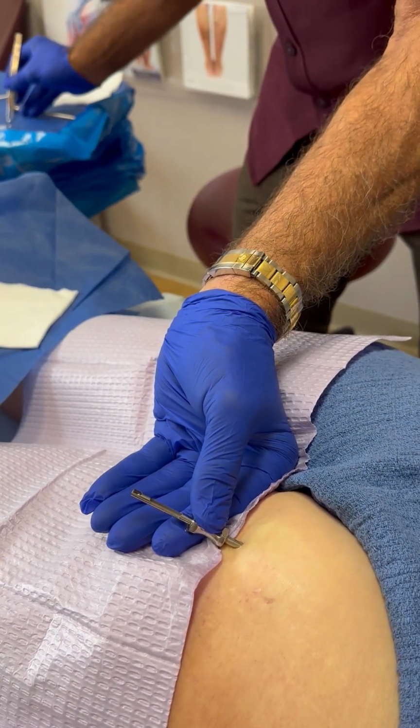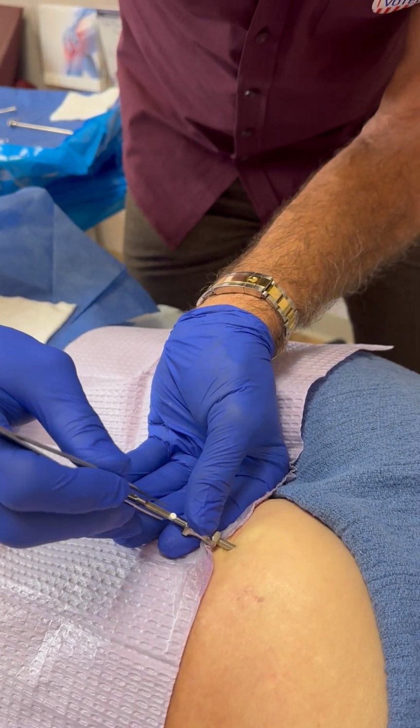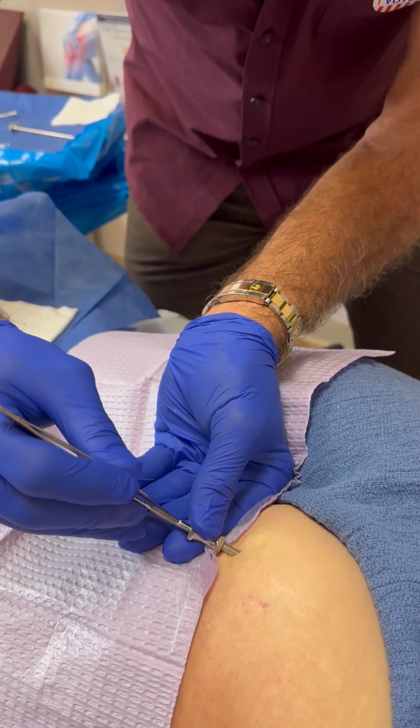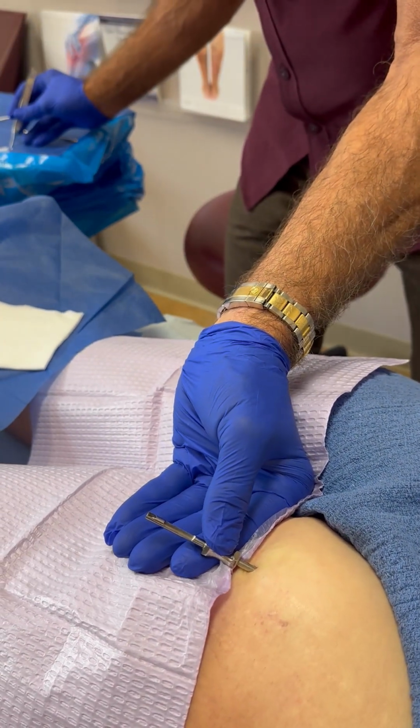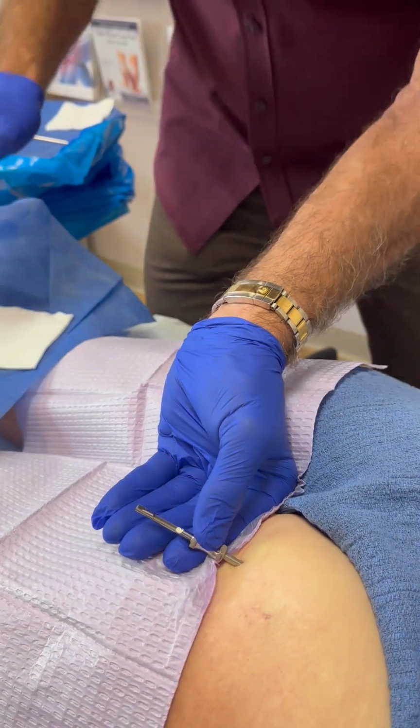There's a 25, that's a 100 milligrams. This is a 25. It's usually 1 milligram per pound, so she's about 125 pounds. And I'm putting in 6 milligrams of estrogen. Again, 1/20th as much estrogen as testosterone typically.